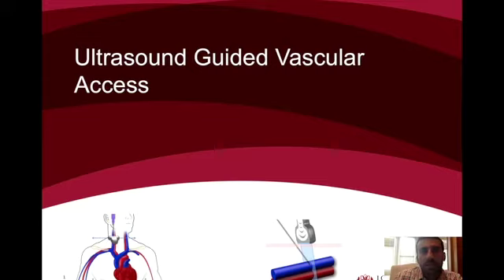Hello. For this module, we'll try to evaluate the utility of ultrasound for vascular access. We'll talk about central vascular access, although this area has been proven and is more common in practice. So we'll try to spend more time on the utility of ultrasound for peripheral vascular access.